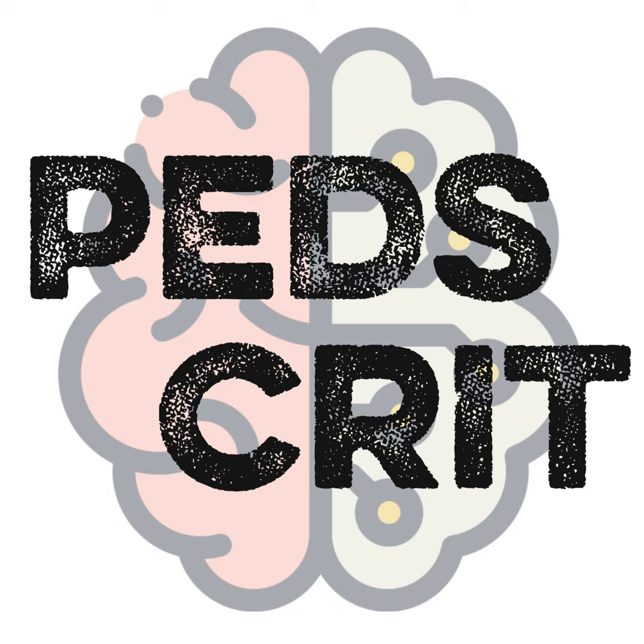Hepatic encephalopathy stage 3 and 4 is going to be an indication for MARS preferentially. So we will consider that patient a MARS candidate. Once we correct their coagulopathy with tandem TPE treatment, we will put them on daily MARS treatments until they get a transplant, if they have ALF. However, every morning, because we have to change the MARS circuit every day, we evaluate the patient to see if there is worsening in their coagulopathy.